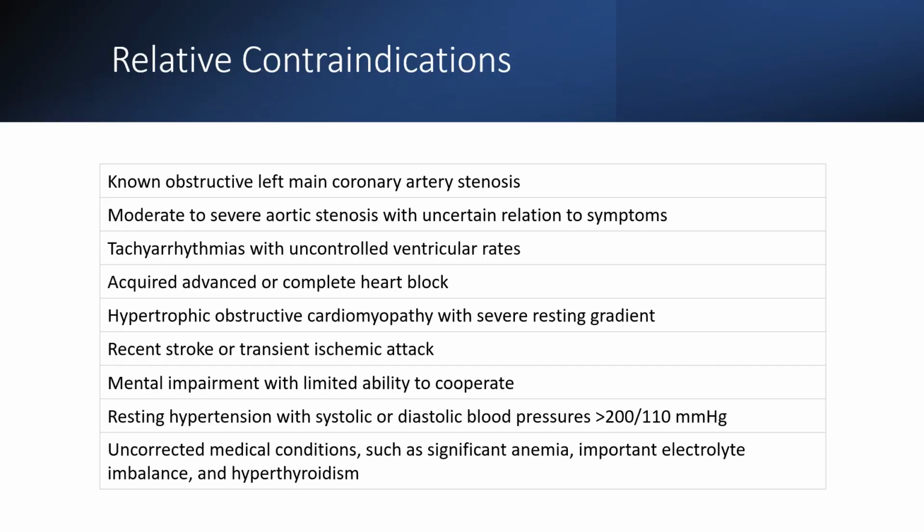Next up is the list of relative contraindications where a stress test may be done but would be considered high risk, and the risk-benefit analysis should be done by the supervising physician prior to stress testing on the day of testing. Please go over this list at your own pace and always consult the supervising physician prior to starting the test if any of these relative contraindications are present.